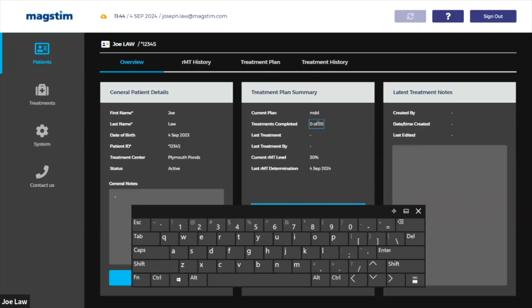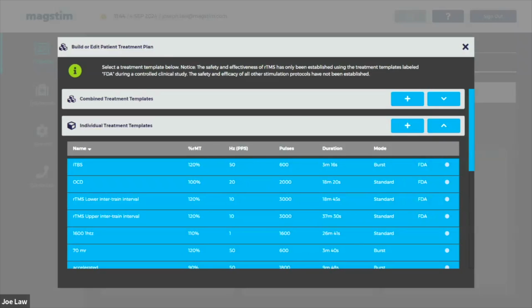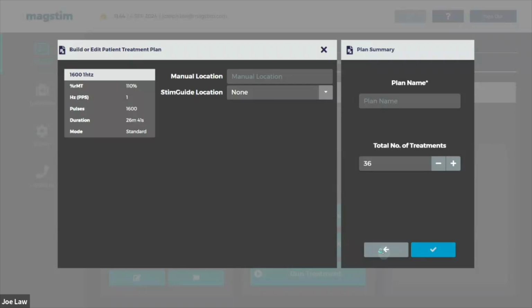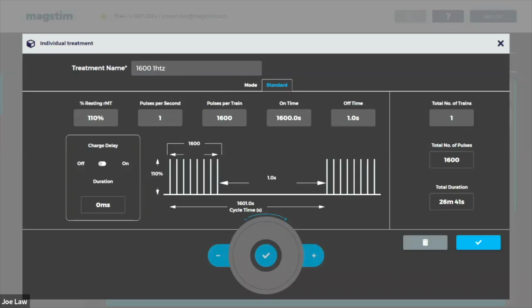If that's not what they were asking, I think maybe they might have been asking this. If, for example, you've got a protocol, for example, theta burst or the 18-minute, I'm just going to click on one of my custom ones. Oh, sorry, I didn't do that right. Let's go back. Click on one of these. You can change the total number of trains. So I'm not sure what you mean by sessions. Is it the total number of trains or cycles during your session, or the actual full sessions themselves? So to answer the question, it's yes on both questions, as you can do it for the sessions or the cycles or trains per protocol.